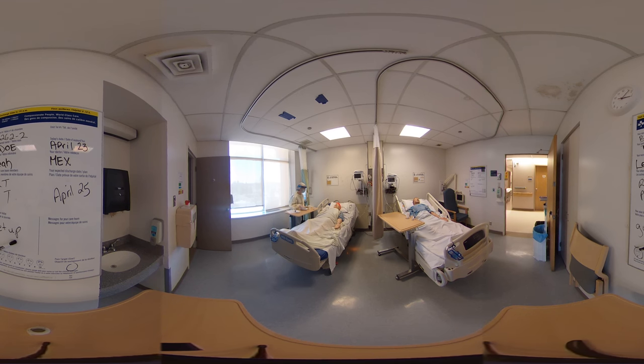I'm going to check your blood sugar, if you don't mind, just before breakfast. I'll enter my employee number, scan the patient, and scan the strip lots. I'll just need to see your finger here — do you have a preference? No, it doesn't matter. So your blood sugar is 8.5, so that's perfect.